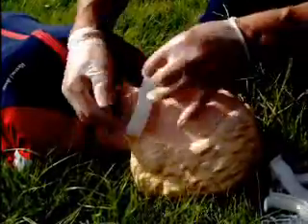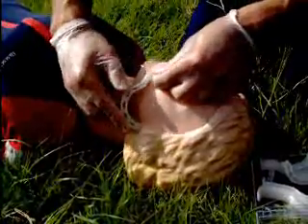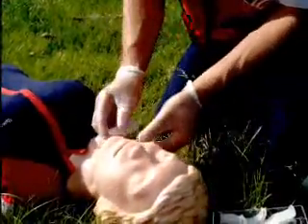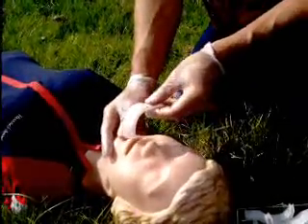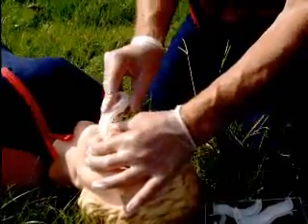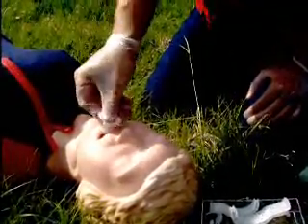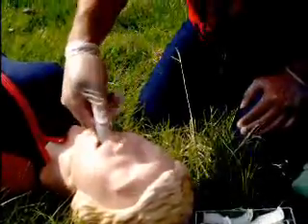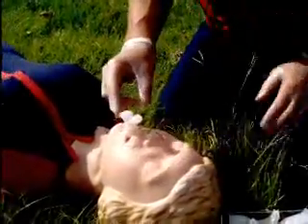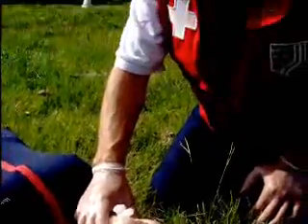So we want it to go about that far, and for her I'm going to take one a little bit smaller because I know it'll fit in fine. To insert, you need to open the mouth and you put it in at an angle like this, and as you go in you rotate around and push it on in. It should go down flush, but this is a CPR dummy, so it doesn't quite fit in. So that's an oral airway.